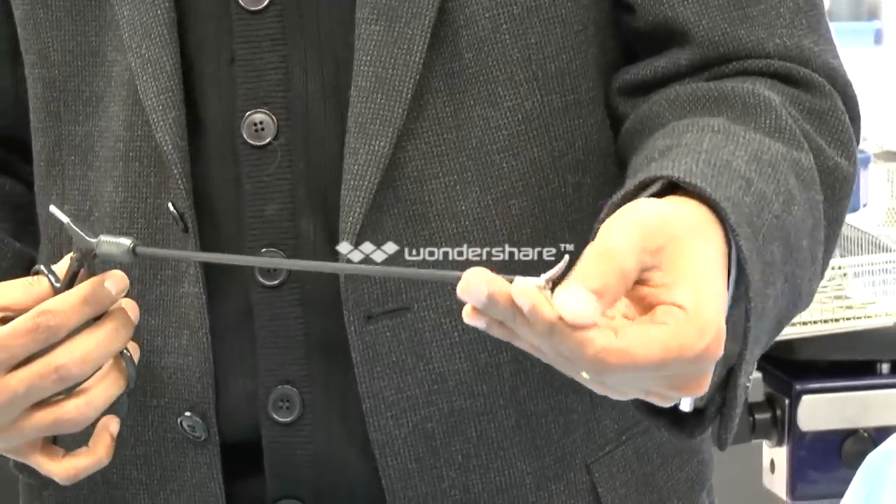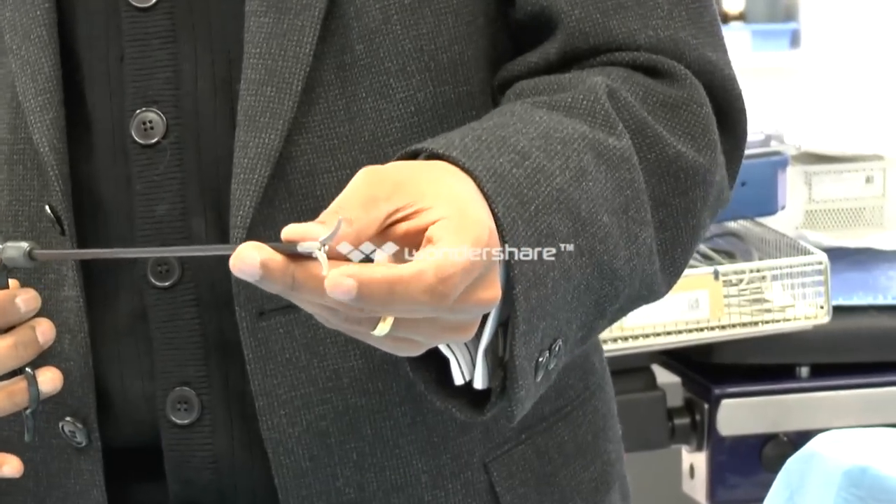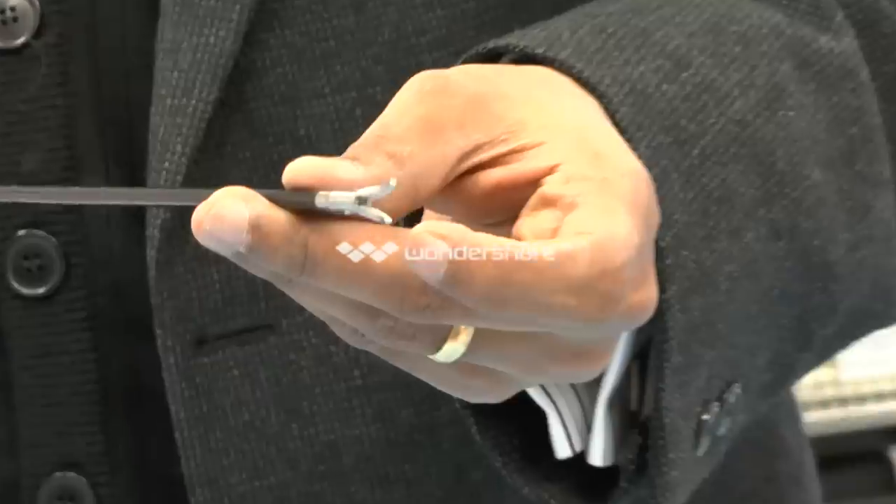This is a Maryland forceps — very fine, and very good at picking up tissue very precisely.